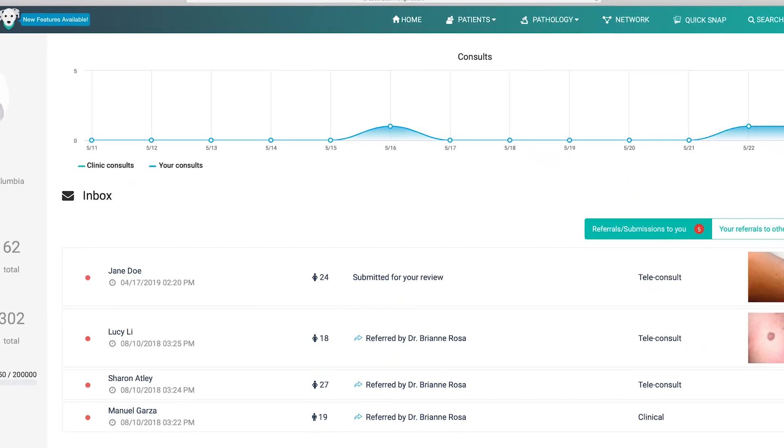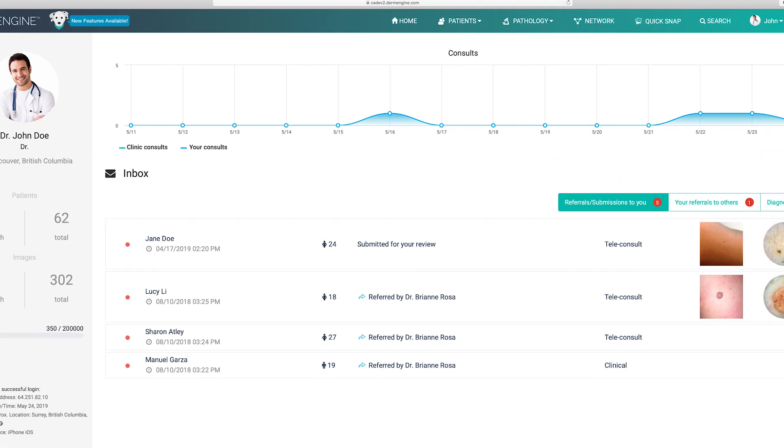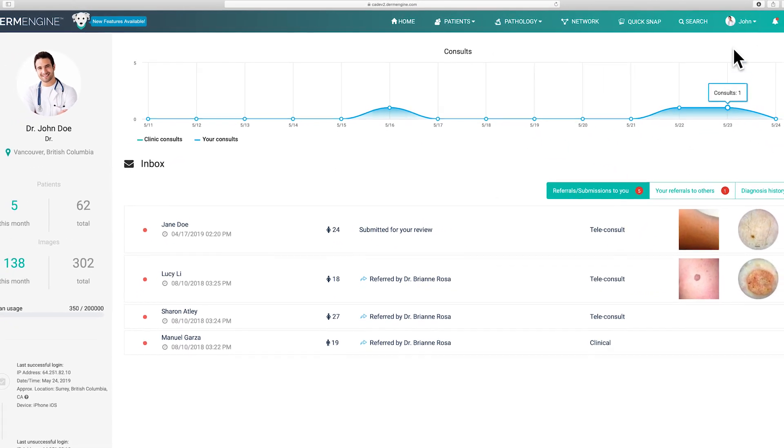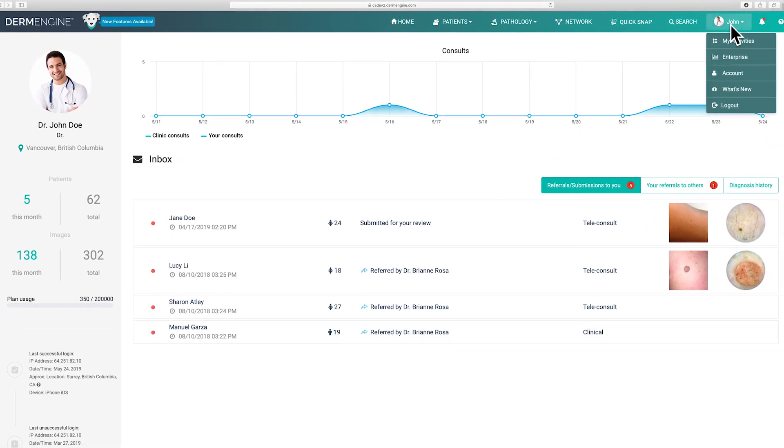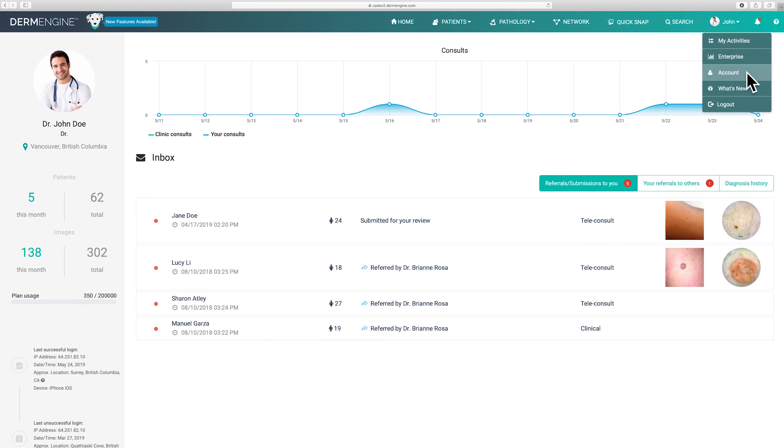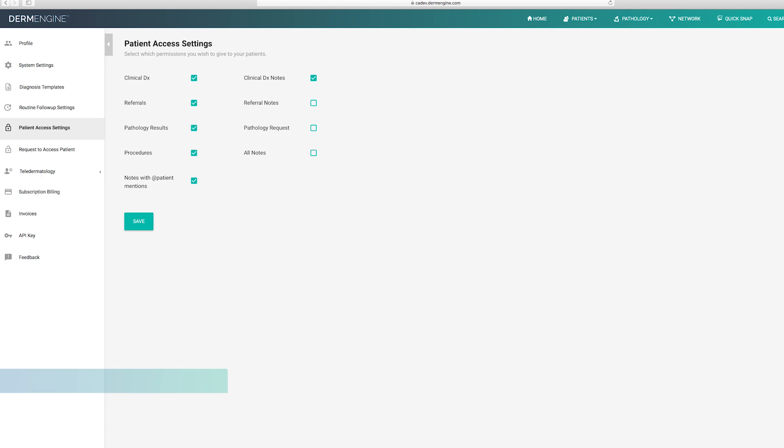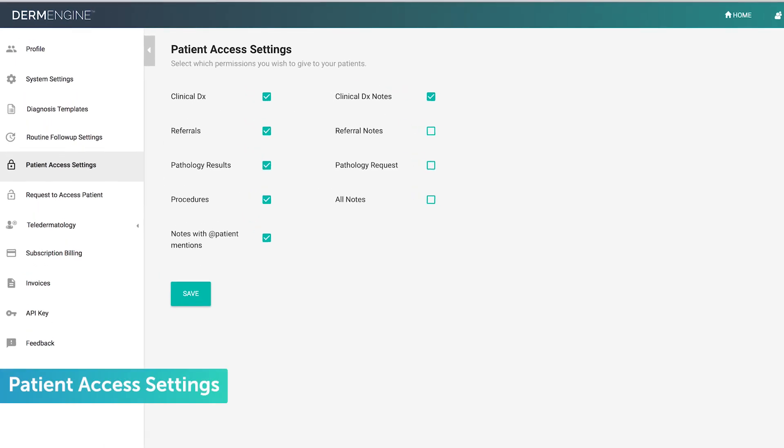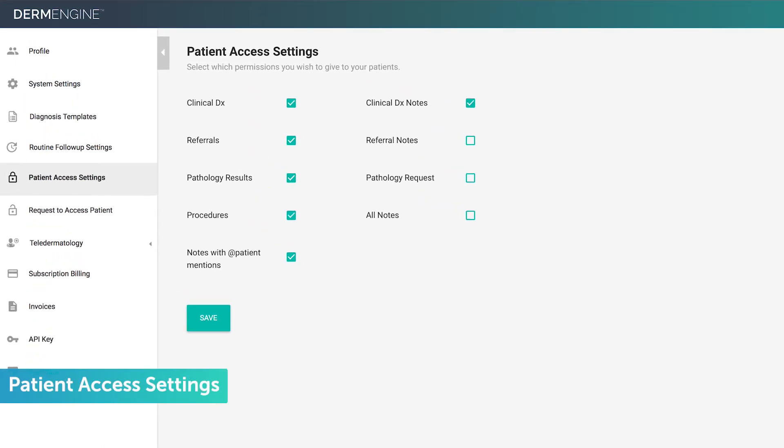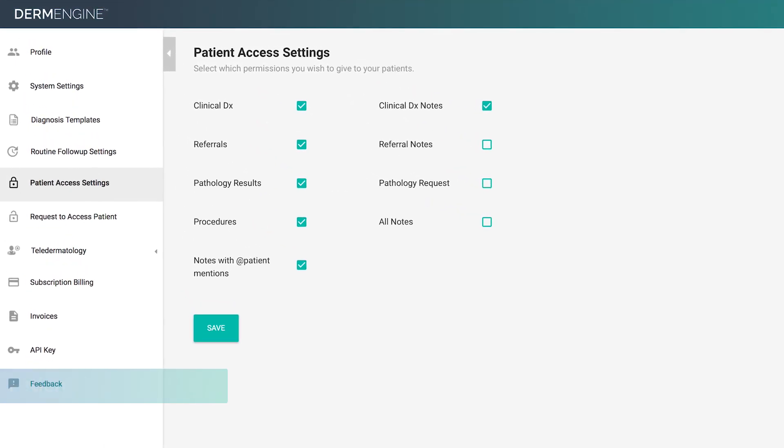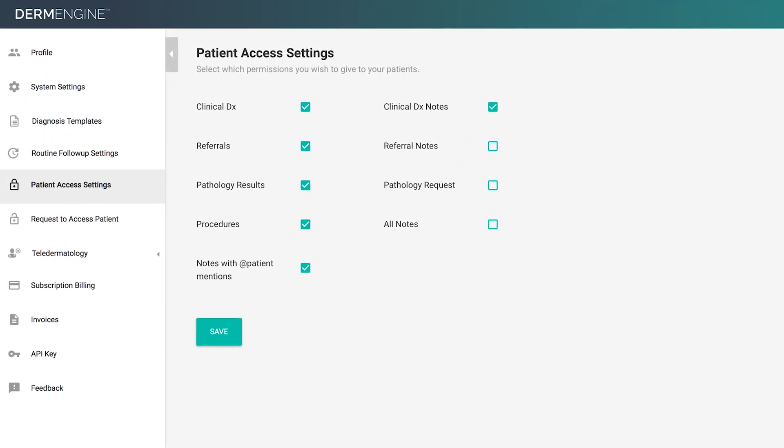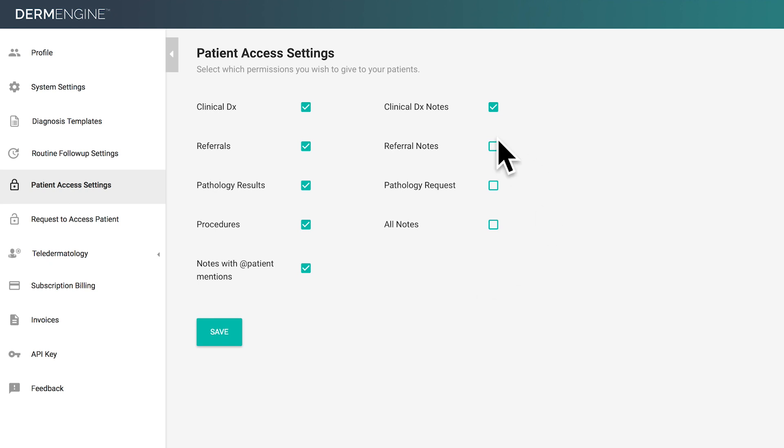Now that you've learned how to share a case with a patient, let's visit your account settings to customize what your patients can access. Here, you can control exactly what information your patients can view. If any of the boxes are checked, your patients will be able to view this part of their file. For example, if you have the all notes box checked, all invited patients will automatically have access to their notes.